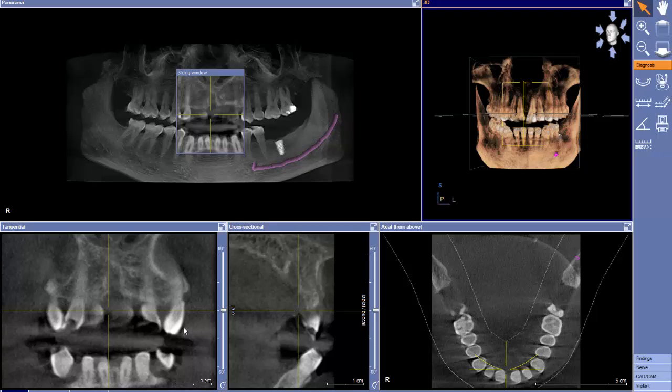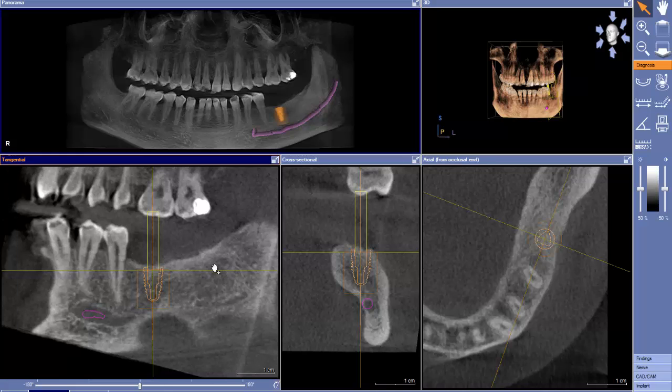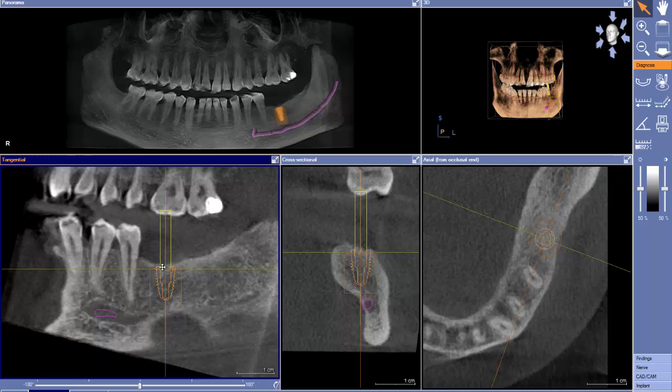I know it's a little bit of a facetious question, but the question is there because the implant seems to be placed randomly without regard for a final restoration. And the reason I ask is based on this look here. If we go to the implant align view, in an ideal world, the implant is set into the tooth, so we would have a molar that is this wide plus that wide on the other side.